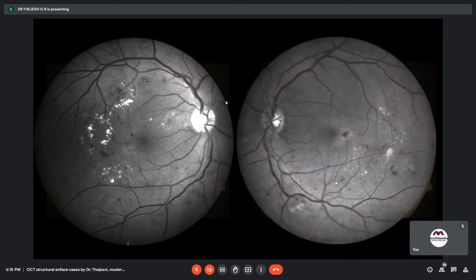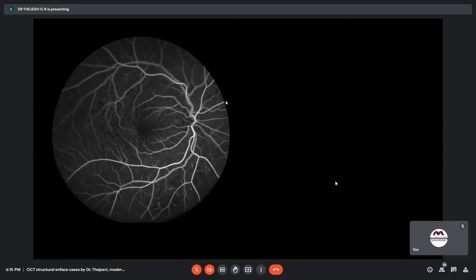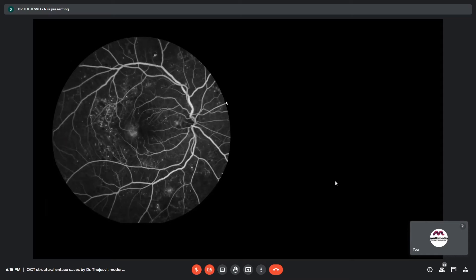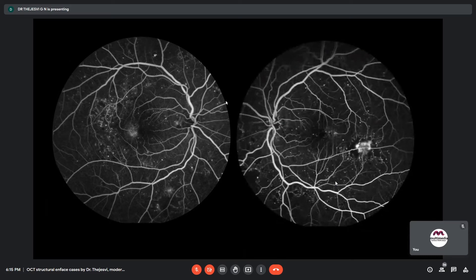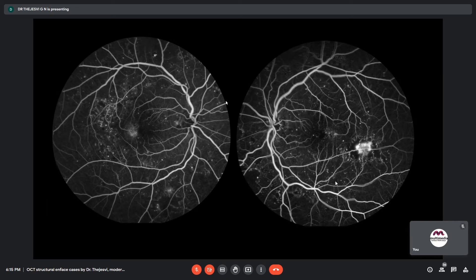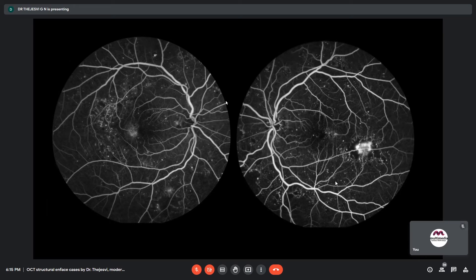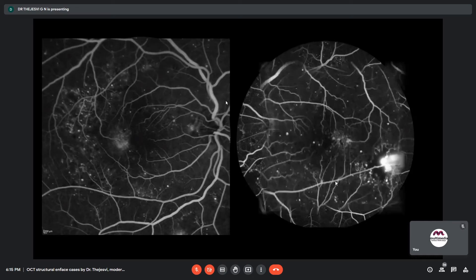The red-free images show findings more prominently along the course of the vessels, and the retinal whitening is more clearly seen. The early phase FFA shows micro-aneurysms, and the late phase shows leakage through the aneurysms with mild leakage temporal to the fovea. In the left eye, the early phase FFA shows NVE temporal to the macula and multiple micro-aneurysms. The late phase shows leaking micro-aneurysms with extensive capillary non-perfusion areas. The right eye also has multiple NVEs.